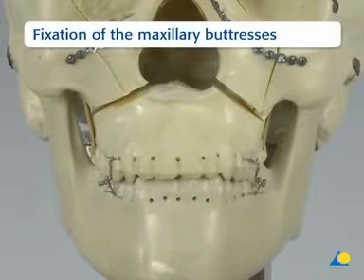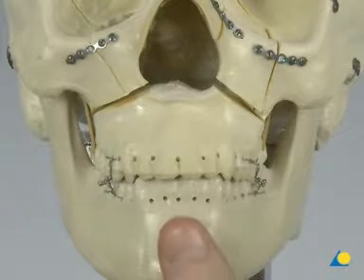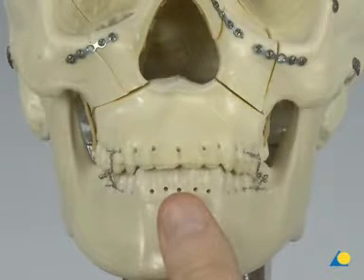If maxillomandibular fixation was not applied earlier, it must be applied now. The maxillomandibular complex is rotated around the condylar hinge axis superiorly until bone contact is made. Small gaps across the LeFort I area are acceptable. Attempting to approximate these gaps by further rotation of the maxillomandibular complex may result in distraction of the condyles from their fossa, causing an anterior open bite when the MMF is removed.